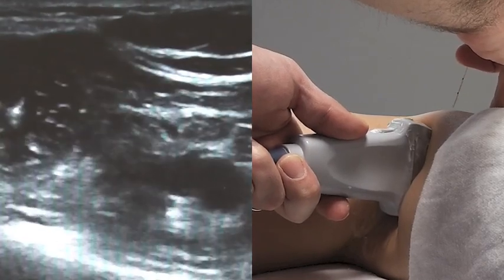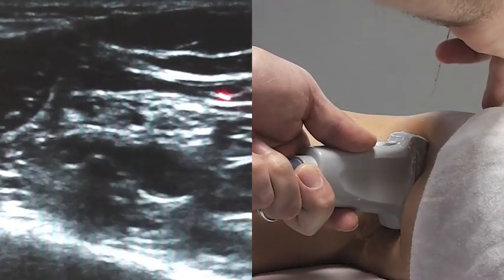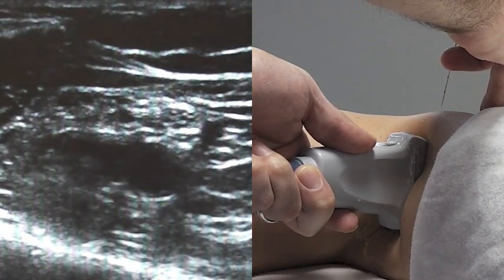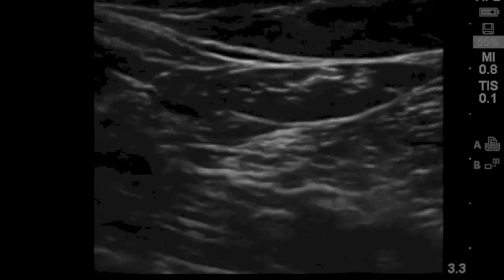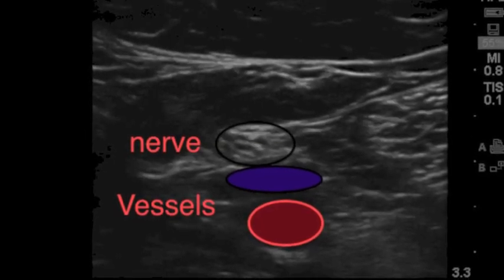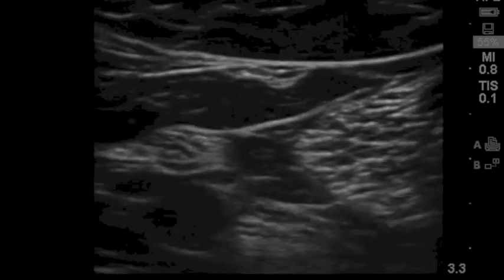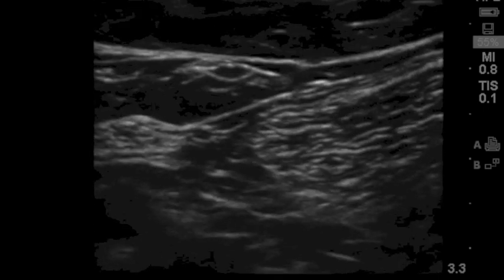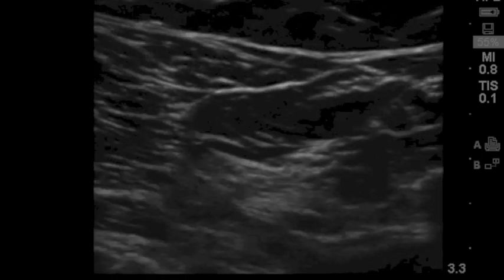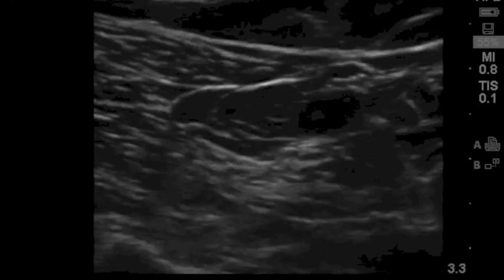Really maximize your view first. Let's maximize our view. Line your needle up with the probe at roughly the depth that you expect the nerve to be, and make adjustments as needed from there. What you see here is an example of another block done this time on a right leg. You can clearly see the sciatic nerve as I play around with the probe, and you see the vessels underneath. I'm just rocking the probe back and forth to maximize my view of the nerve, taking time to see the nerve as best I can and to see where it splits into the two divisions. Moving caudad, separating; heading cephalad, joining.